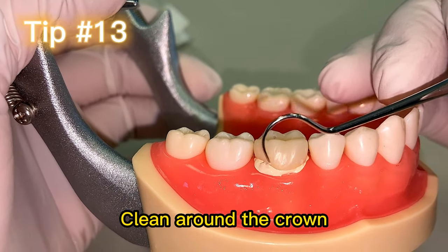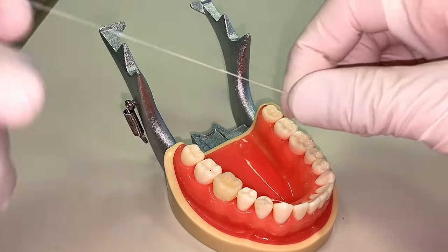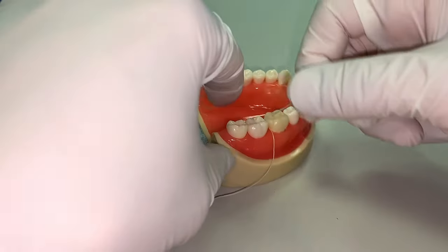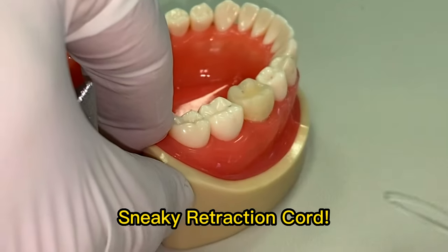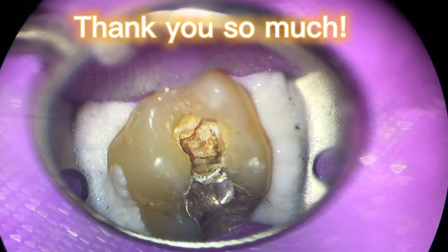Tip number thirteen: take the time to clean around the crown once you've cemented it. In my experience, the cement may actually cause post-operative problems. And if you took an impression during that appointment, you might actually find retraction cord that you forgot about — yes, I'm being honest here.